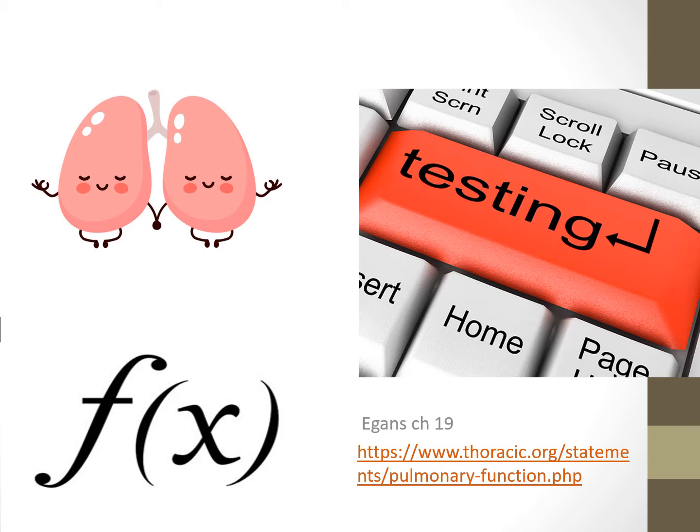So lung function testing is becoming more and more prevalent, not only in the hospital for patients at the bedside, but even some of the mechanical ventilators are starting to do some pulmonary function aspects, because we want to see how healthy or sick the patient's lungs are. So we're going to look at compliance, airway resistance.